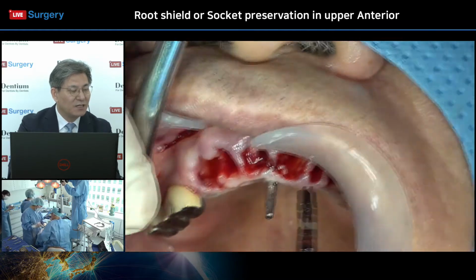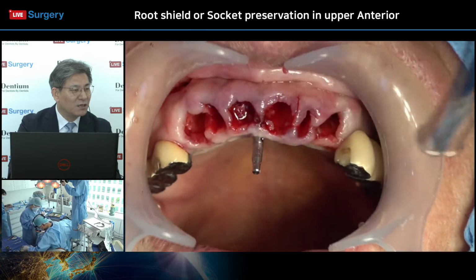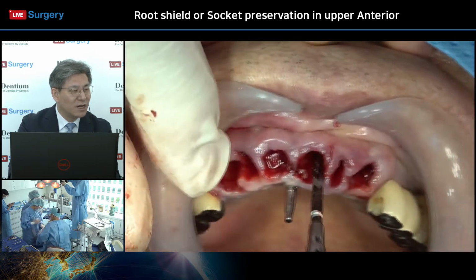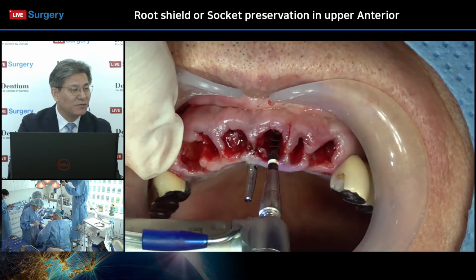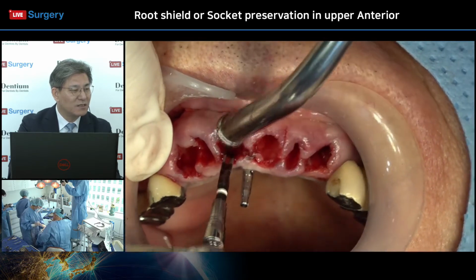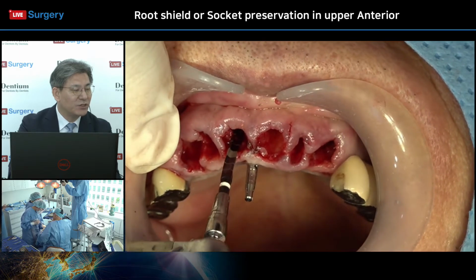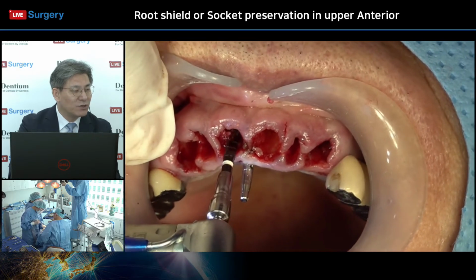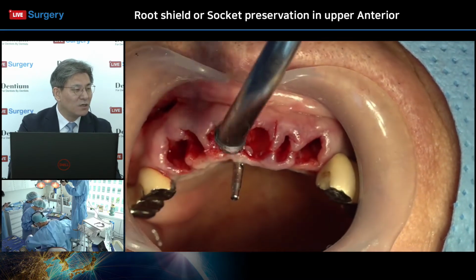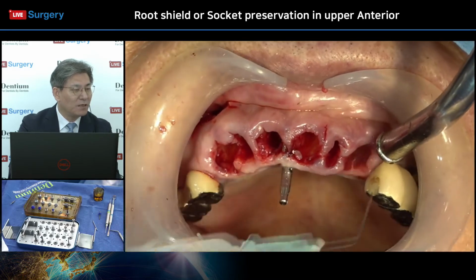All of these manual type procedures are an essential part, even though you try to have digital guided surgery. When you have digital guided surgery, who designed the proper position of the implant fixture? Your technician or some assistants? Anyway, it doesn't matter. However, final confirmation belongs to you. So you need to know about the three-dimensional positioning, right?